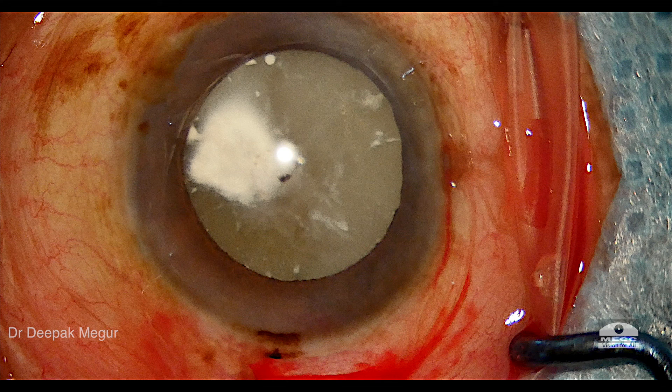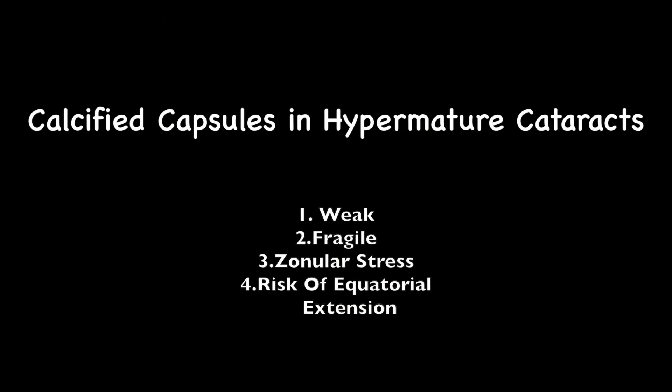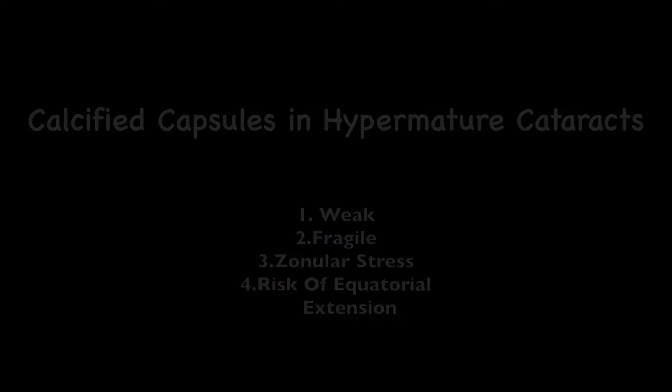Calcified capsules in hypermature cataracts are challenging because the rhexis is difficult — the capsule is weak and fragile, there is an increased tendency of zonular stress, and there's always a risk of equatorial extension.